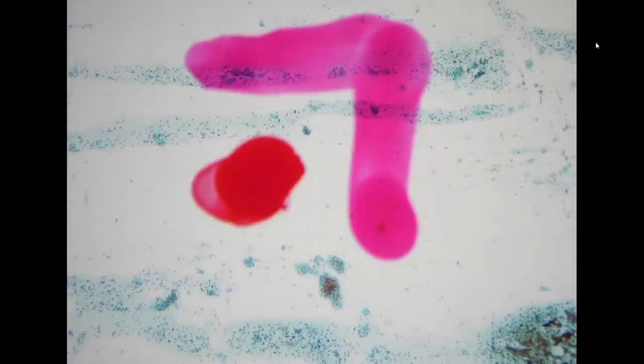At the edges of this specimen, we start to see individual cells in very tight clusters, and the cells do show nuclear atypia. I think the degree of atypia already exceeds the usual AGC, atypical glandular cells. So I think this is favor neoplasm.